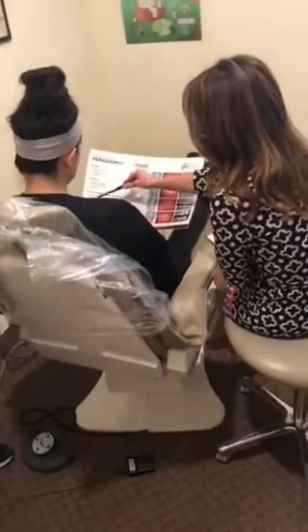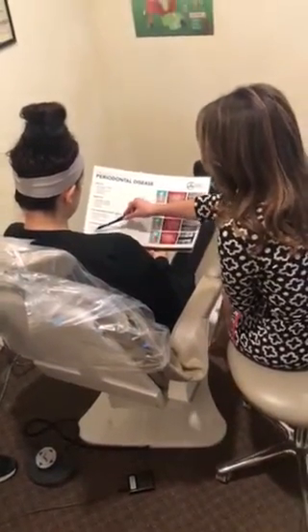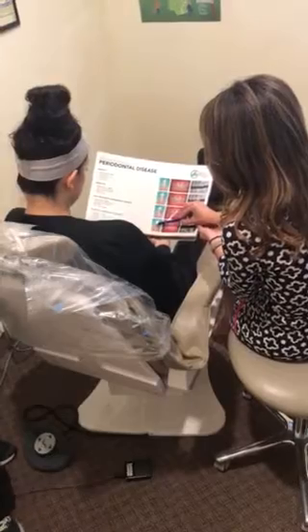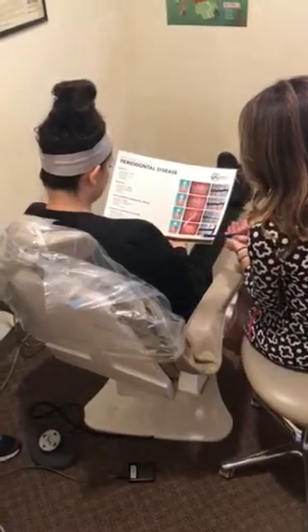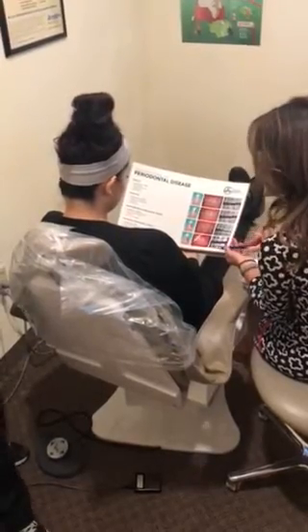In an advanced stage, it's just 7 millimeters or greater, and so this infection is really advancing now through the tissue into the bone, and so we're getting more bone loss up to 5 millimeters or greater. And what I want you to see here is that if you look here, the bone's way high, we've lost about half the bone here. And so there's lots of infection you can see underneath on that root of the tooth. If I touch this, it bleeds, but if we look here, we can see that bone is way down here.